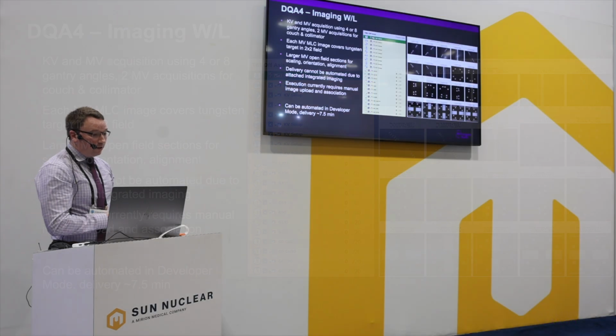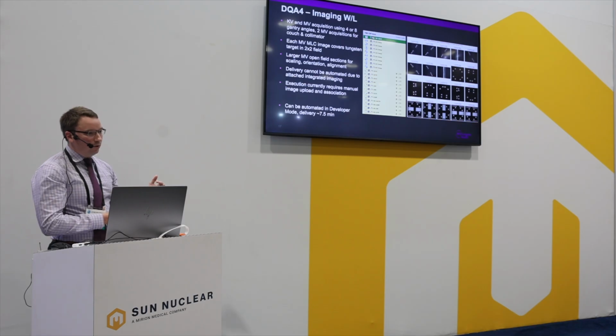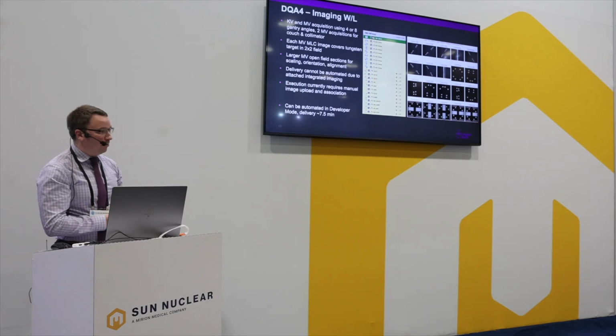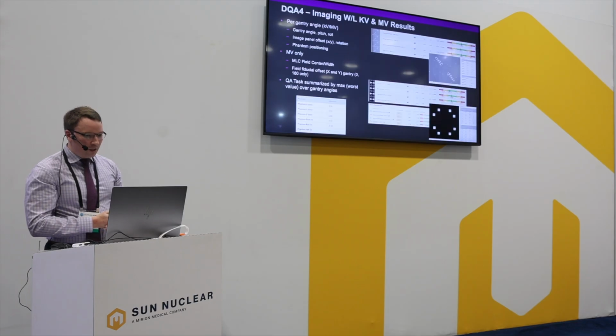And unfortunately, delivery can't be automated for this, because when you do integrated imaging or any sort of imaging, you can't just step to the next one. But that being said, taking all these measurements, I didn't want to do this manually, so I created a developer mode script for TrueBeam that allows automated acquisition of all of these. So this is a look at what the results look like.